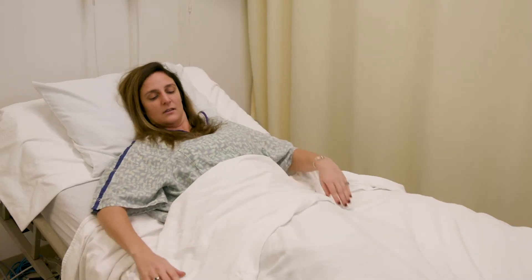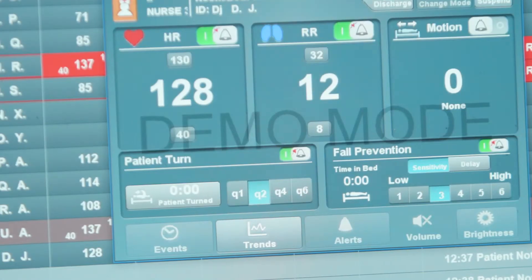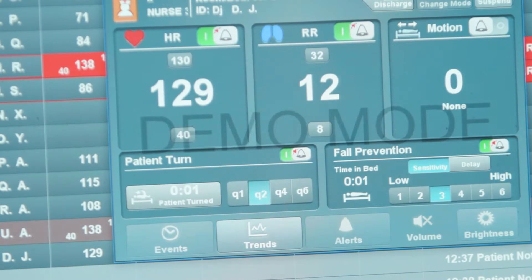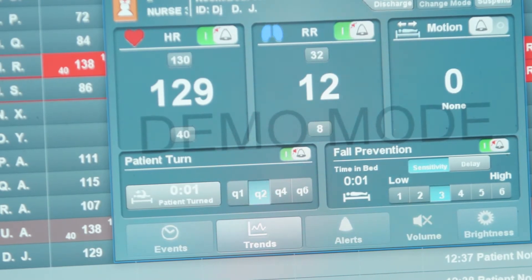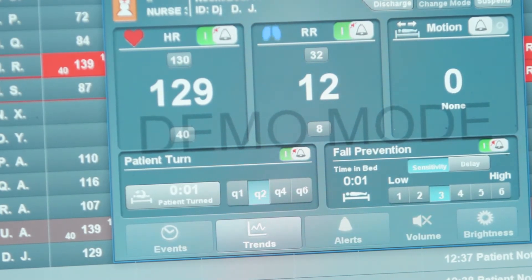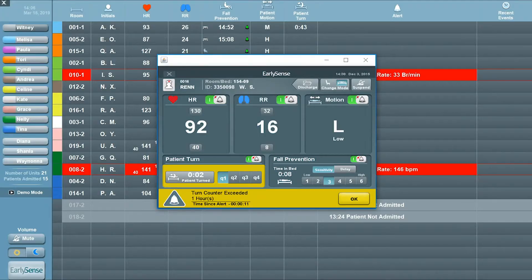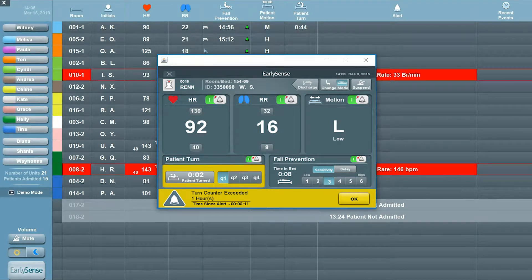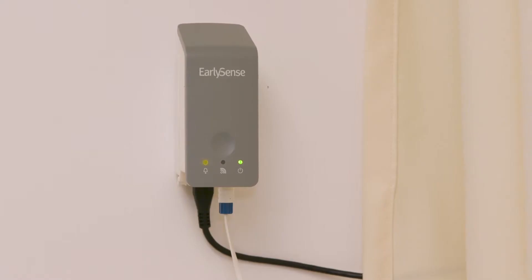When a patient lies in bed, the counter will automatically start counting towards the required time for the alert. After the time has passed, a reminder will be generated as a yellow alert displaying Turn Counter Exceeded, and the Insight will flash a yellow light.